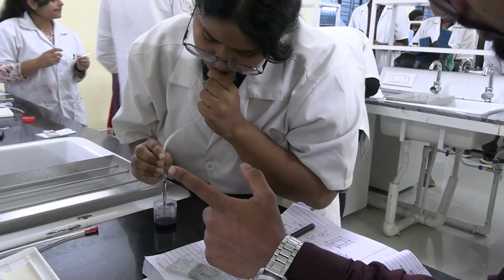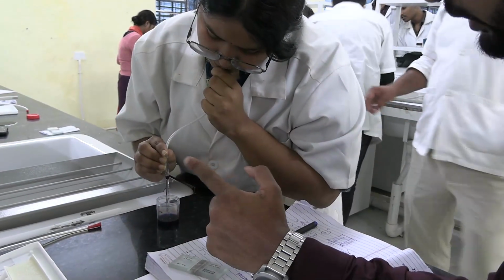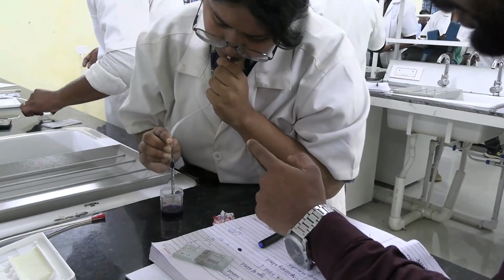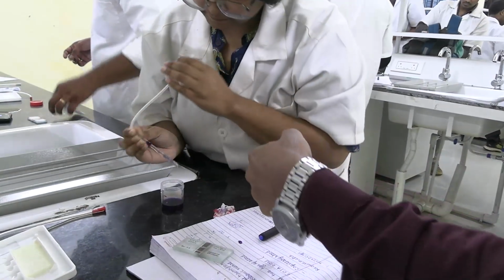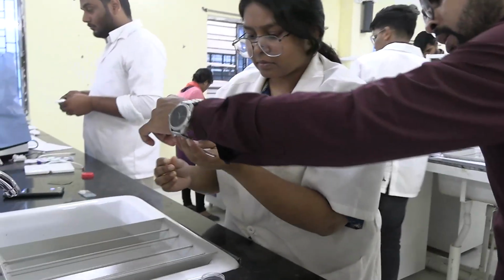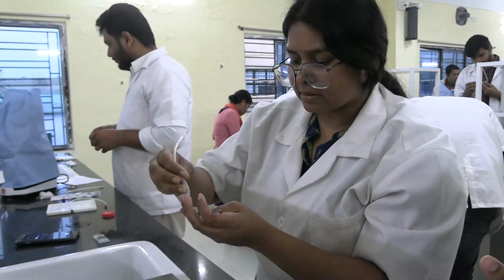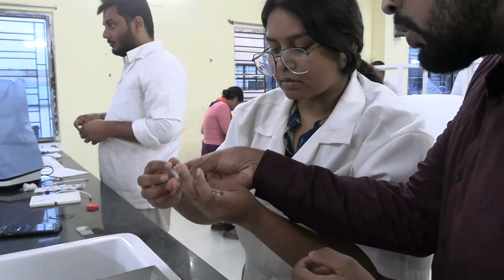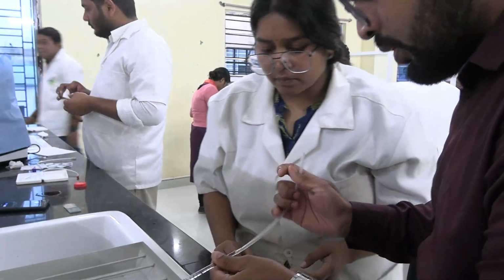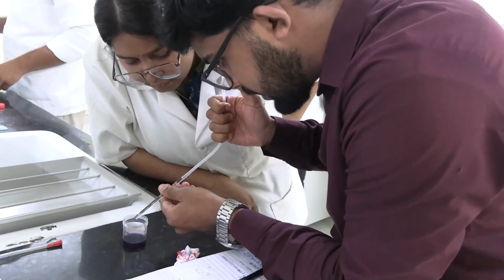Bring it up to the 11 mark, then immediately make it horizontal. Or you can keep the pipette in your mouth and make it horizontal. Make it horizontal. Now discard the extra part. Don't tilt it. Discard the extra part, don't count it. How do you discard? You don't know? See, remove your hand. When you draw the fluid, see how to discard.